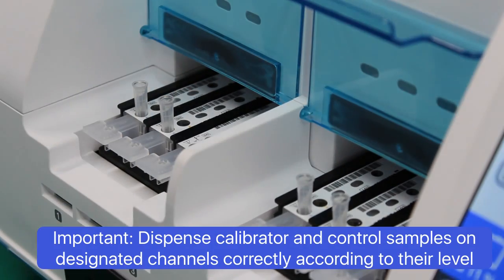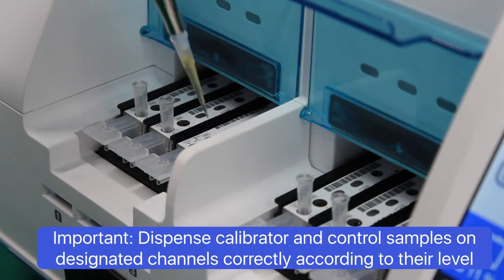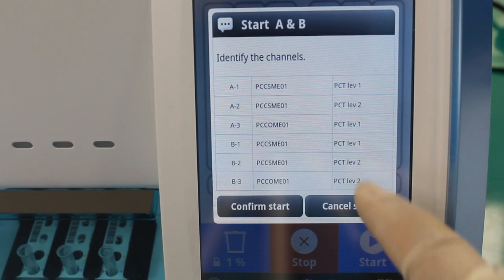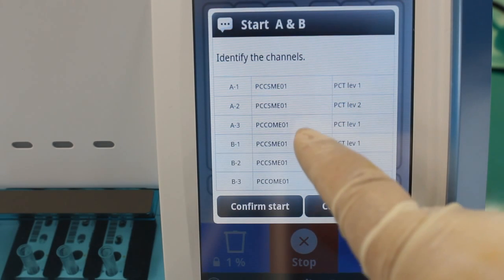We will test level 1 control in channel 3 and level 2 control in channel 6. Then press start. Check and then confirm start.